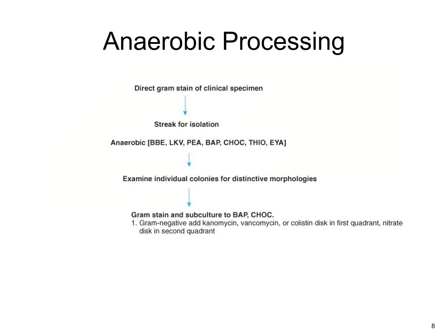When a specimen is submitted for possible anaerobic culture, or if the physician suspects an anaerobe and sends an anaerobic culture, then the sample may be reviewed with a gram stain for a direct testing method. So for example, if it was an aspirate fluid, then the gram stain would be made of the fluid and reviewed to see if there is any sort of organisms present.